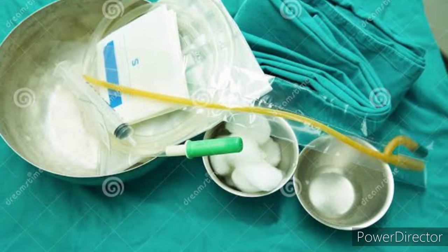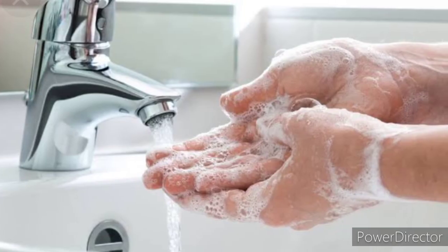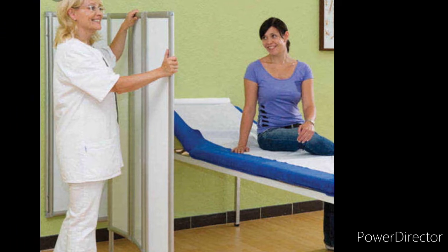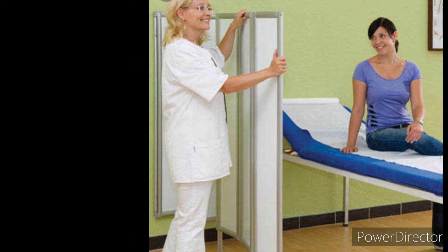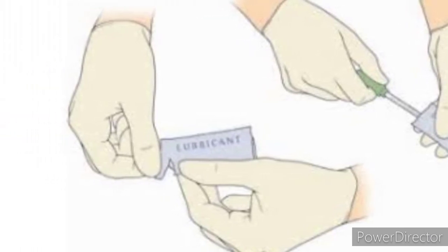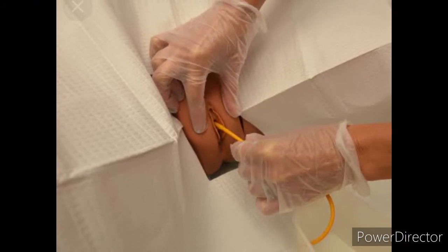First, prepare the articles. Sterile technique should be maintained — wash hands and wear gloves. Provide privacy and explain the procedure to the patient, then position the patient. Clean the area before inserting the catheter. Apply lubricant for easy access, then insert the catheter. After inserting, urine will flow through the bag, confirming the catheter has reached the bladder. There are certain marks on the catheter indicating how far to insert it for male and female patients.